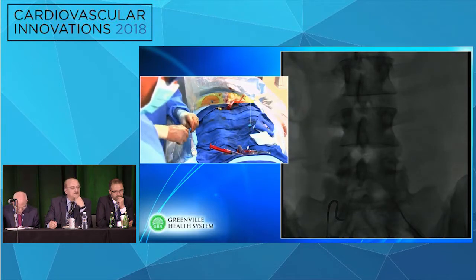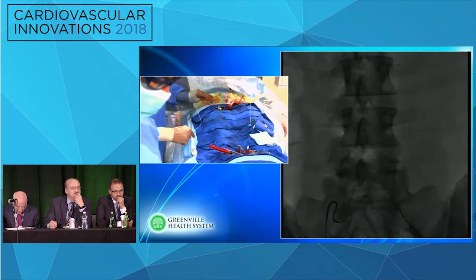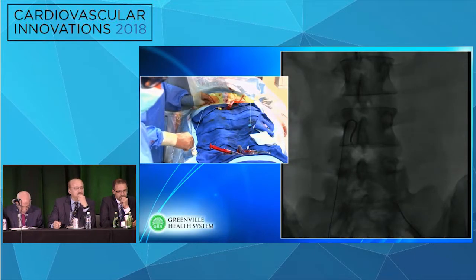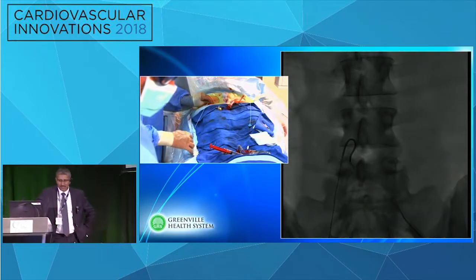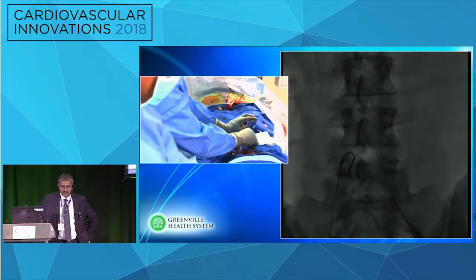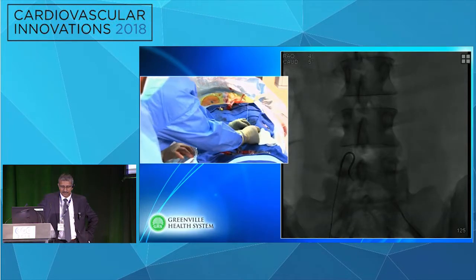I would just flip the patient. That seems too low to me. Too low. That is low. That's just too low. I come in right underneath here, right there. Have that confianza.